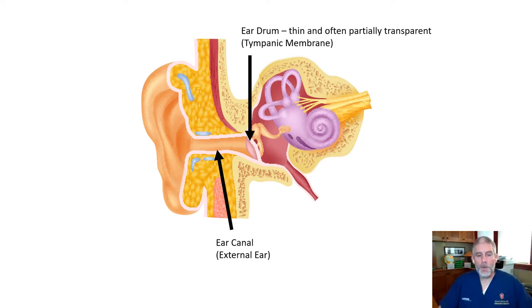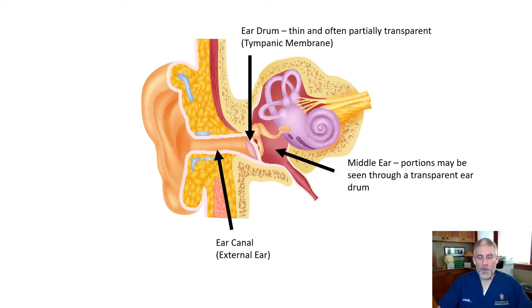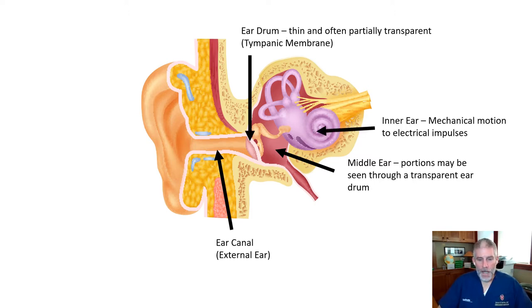Next is the eardrum. The eardrum is a piece of very thin tissue — actually three layers — but still very thin and transparent, that separates the external ear canal from the middle ear. It translates movement of sound waves to mechanical motion, and that mechanical motion is communicated via the chain of bones in the middle ear to the inner ear. The inner ear is where mechanical motion is translated into electrical motion. This is an area we can never see with the otoscope under normal circumstances. The best we can hope for is certain elements of the middle ear.